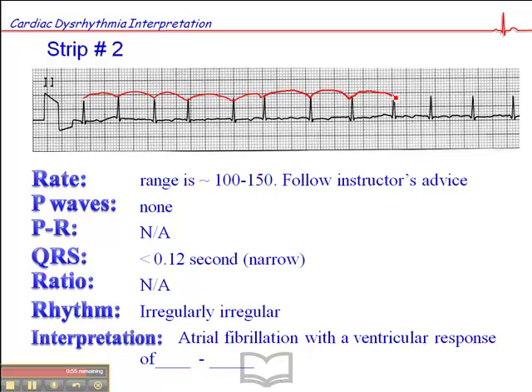It's the most common dysrhythmia in the elderly, and it's the one rhythm you can pretty much interpret from just checking a pulse. Not only will it be irregularly irregular, but the volumes will be weak, strong, in between — all over the place. So this is AFib with a ventricular response of between 100 and 150.